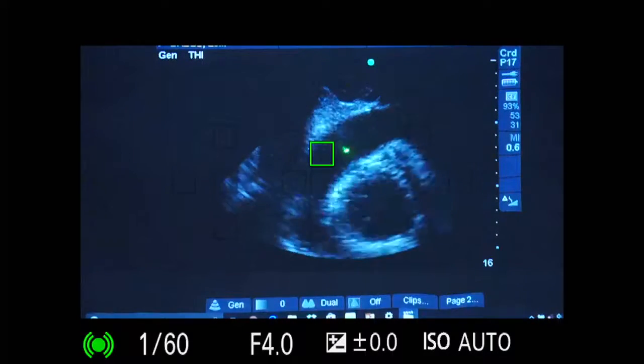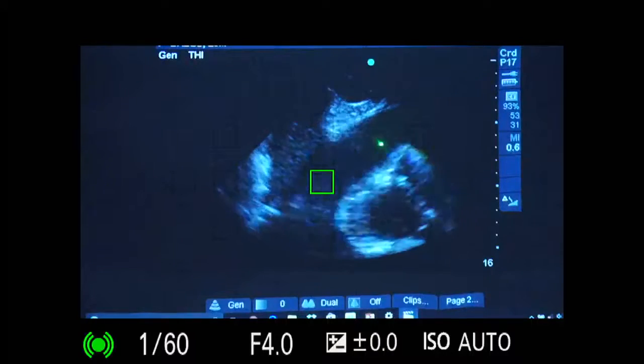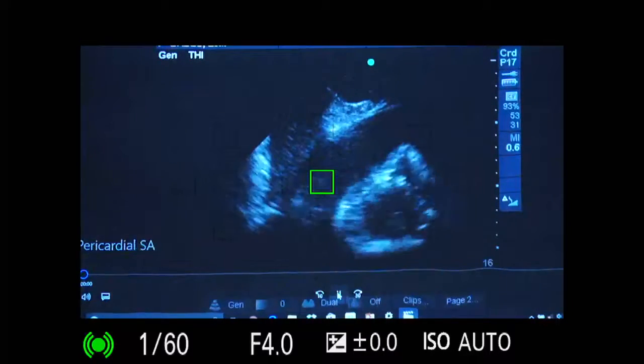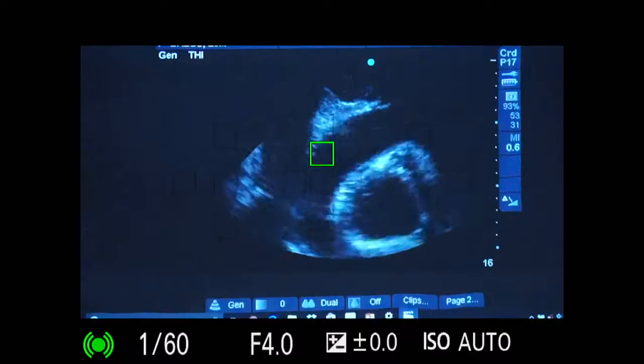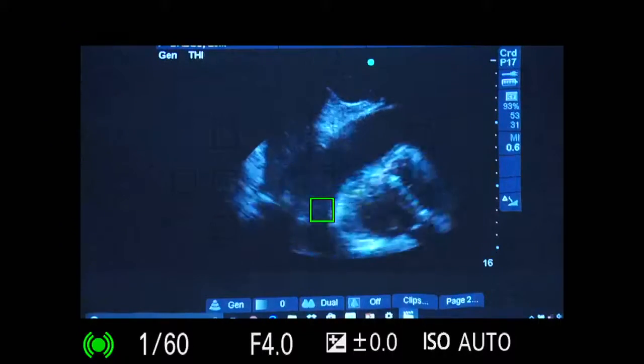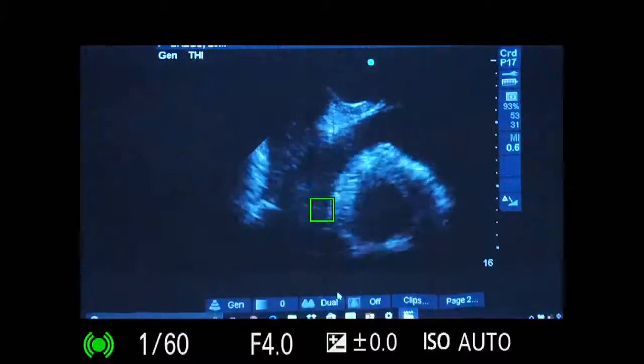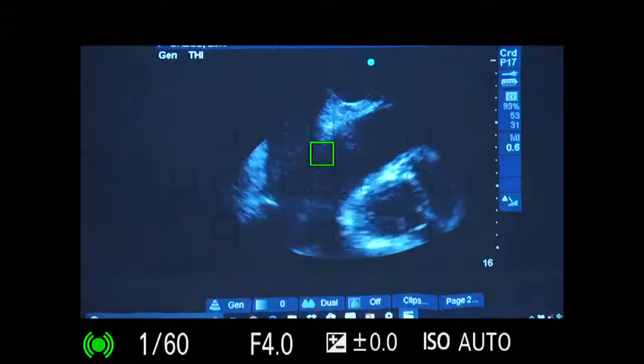Absolutely. And how do you say it is tamponade? What are the features? You are right. Patient has tamponade. That's fine. Anechoic shadow is fine. What are the features of tamponade he has? Ultrasound wise. Anybody want to add? Yes.